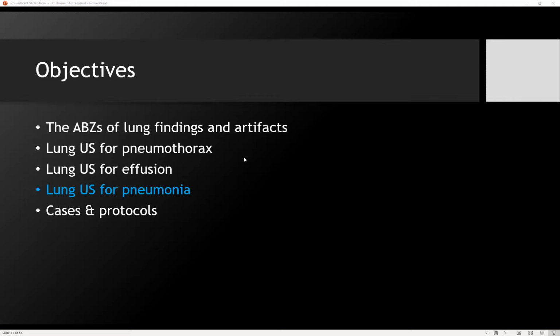Thank you, Colleen. I guess on that topic also, sometimes if you're overgained, you might see artifact that appears to be stuff that might make a simple effusion look not simple. So you might also want to reduce your gain, but it sounds like this magic button that Colleen is mentioning would be even better. So thank you.